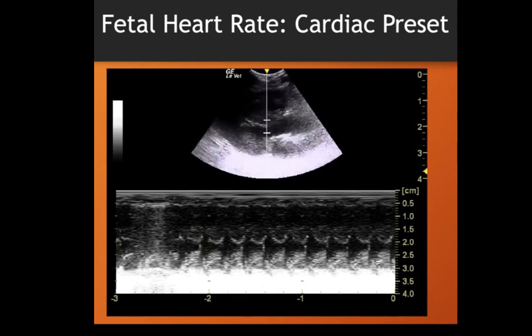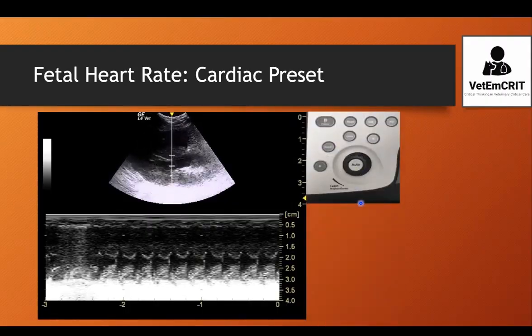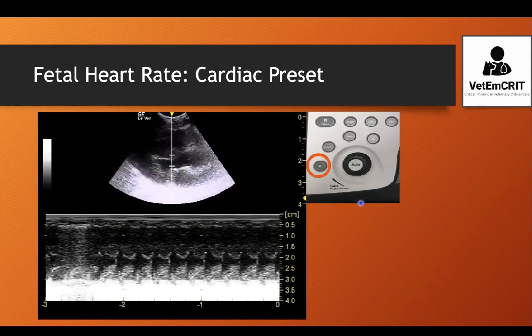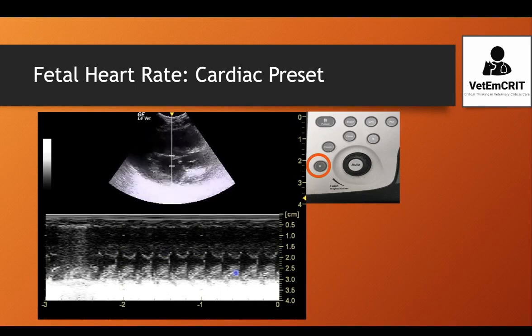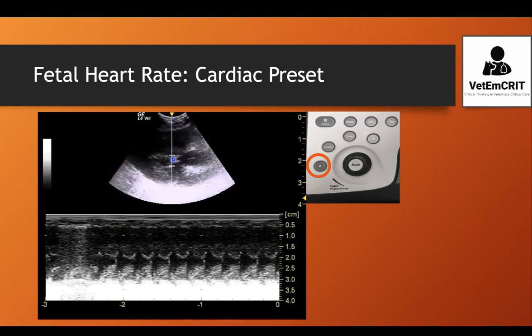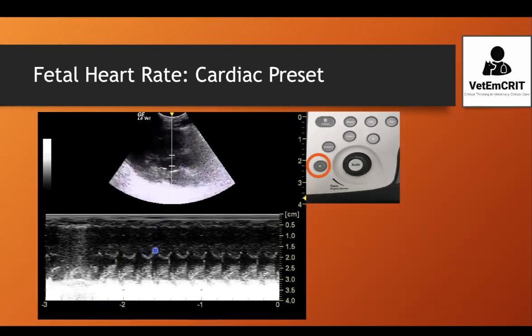As soon as you identify the fetal heart and optimize your image, making it bigger, you want to turn on M-mode. M-mode stands for motion mode — it allows an operator to evaluate motion in a still image, as depicted on the bottom picture here. Once you turn on M-mode, you want to put the cursor across the heart so that you can see the different phases of heartbeats in M-mode below.